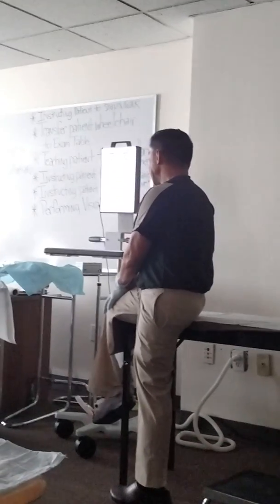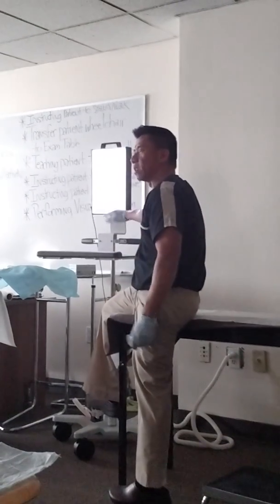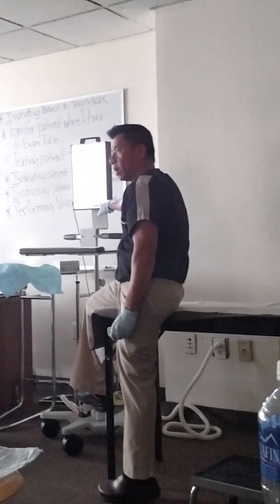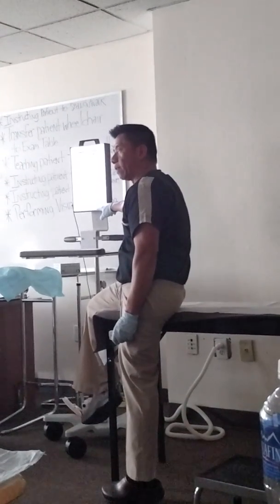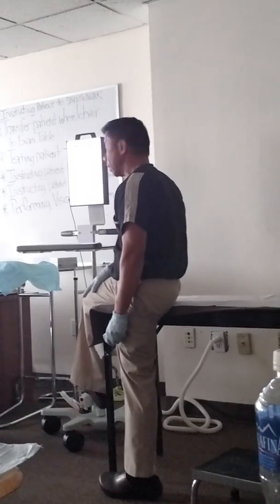Okay, so now I'm looking at the letters. It's L D O C O T O P. So he missed two letters. So that is the 20/20 line. Because he missed 2 letters, I'll give him another chance. That's without the occluder, without the pinholes, right?